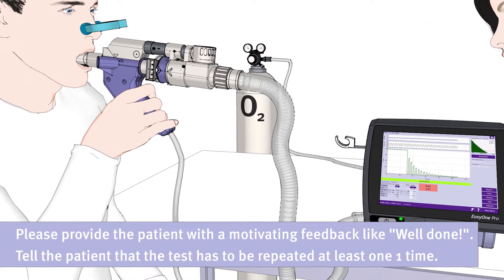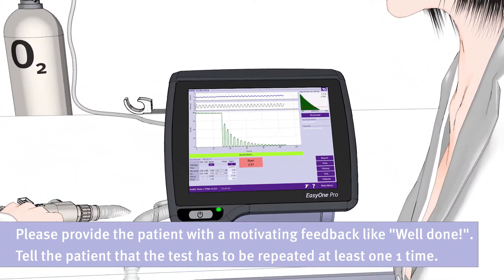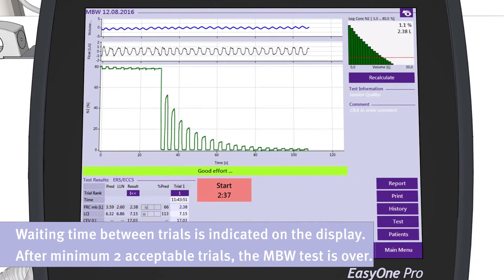Please provide the patient with motivating feedback like 'well done', and tell him that the test has to be repeated at least one more time. The waiting time between trials is indicated on the display. After a minimum of two acceptable trials, the MBW test is over.